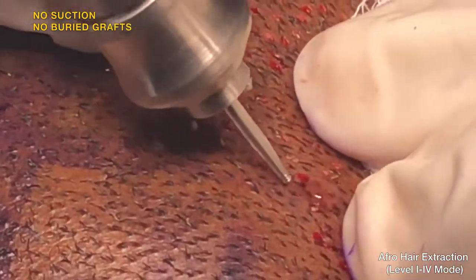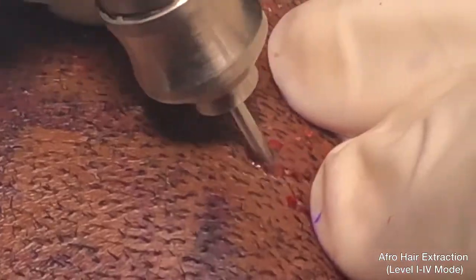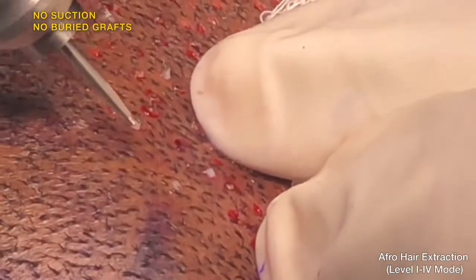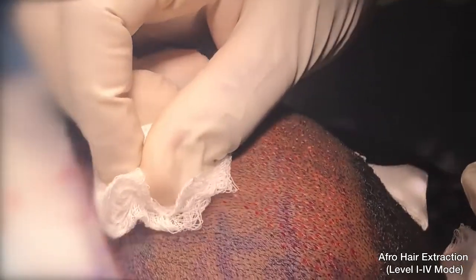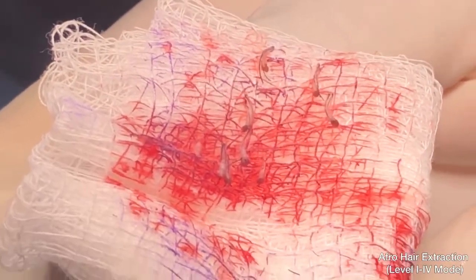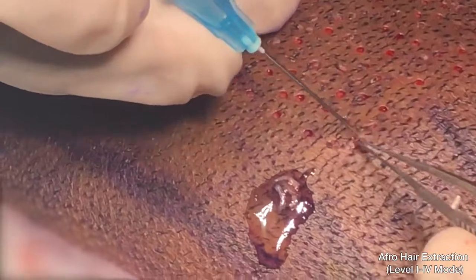For the doctor, it is helpful to minimize the mental and physical exertion needed in guessing and when trying to skillfully navigate hair curl and bend angles for each extracted graft. In a procedure of thousands of grafts, that would have been very exhausting. By minimizing this, the Dr. U Graft Revolution working together with its intelligent punch is highly advantageous.